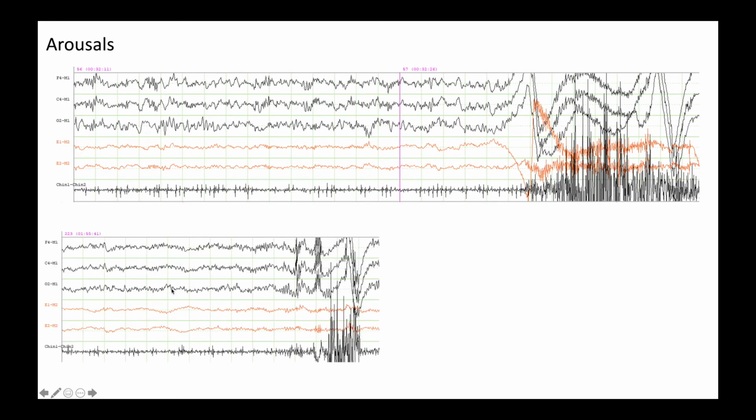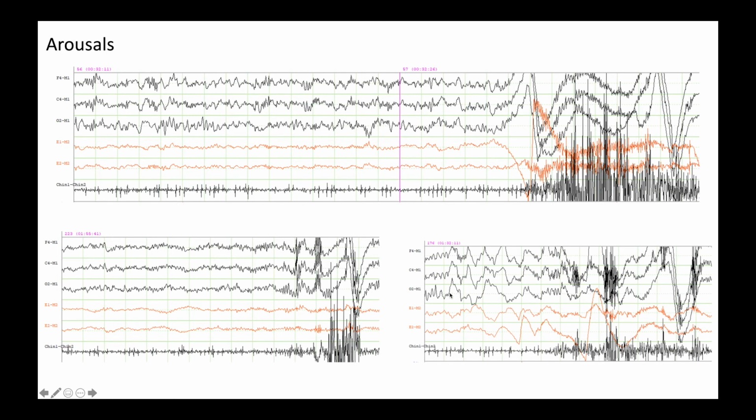In this arousal here, you can see this is probably low amplitude mixed frequency, I think probably N1, because you can see maybe there's some slow rolling eye movements here, but suddenly the frequency increases and you get some alpha in here and even some increase in the chin tone. So this is another arousal, and there's even some movement of the patient's head probably because you get a big deflection in the EEG leads. And lastly here, this is an example of what looks like stage N3 sleep.